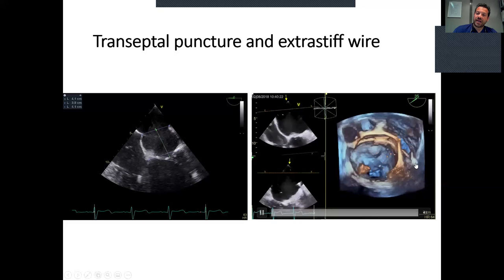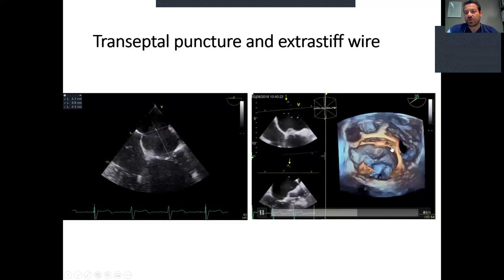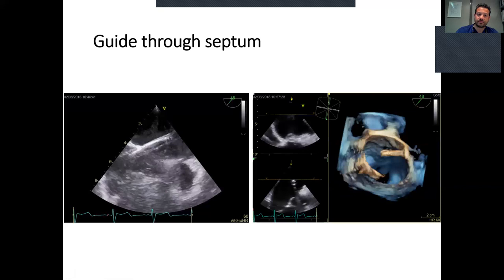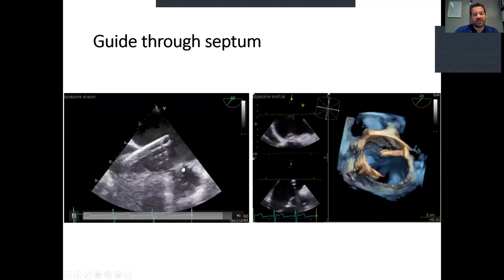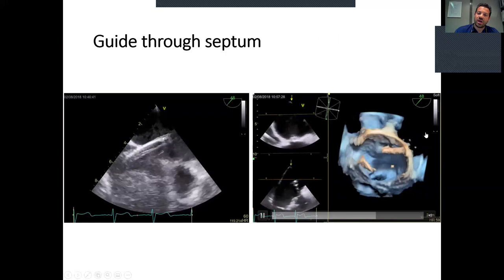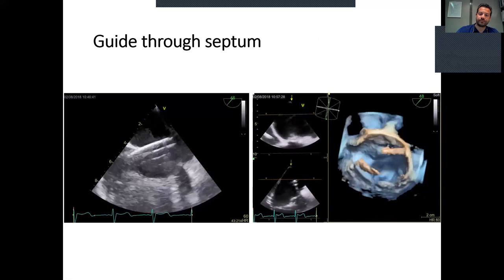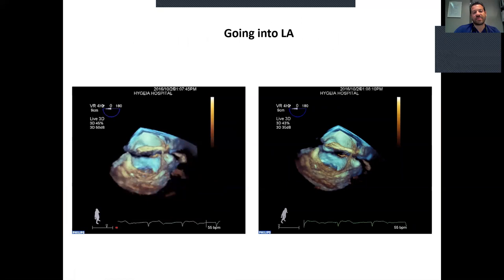At this step, it is important to guide the wire towards the pulmonary vein, because we don't want to perforate the left atrial appendage. Over the wire, we advance the guide. Here you can see the delivery system into the left atrium, and with 3D views we can demonstrate the direction of the guide. Then the next step is to advance the Pascal system.